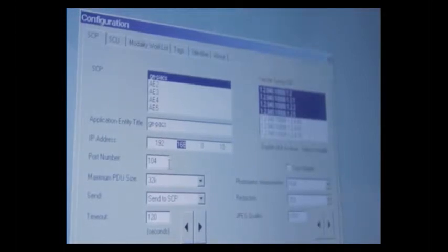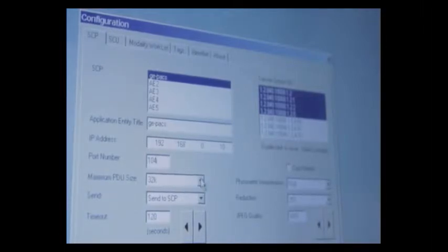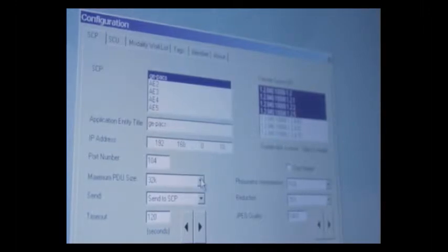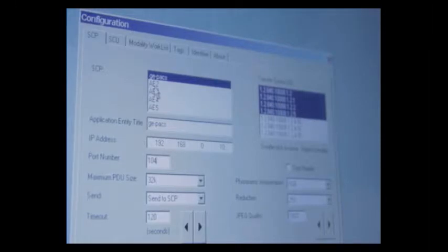The next tab we have here is where the port number of your image send server goes. You want to make sure that these settings are set up from the start. Maximum PDU size, 32K is good. You want to make sure this is enabled Send to SCP.